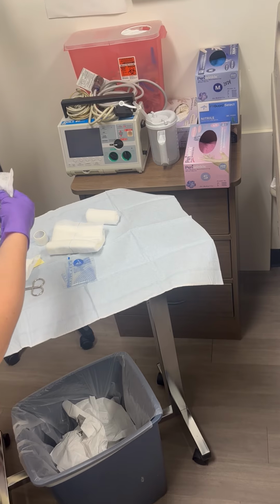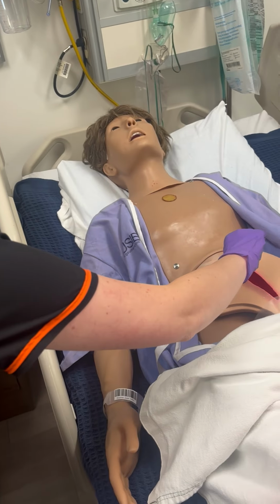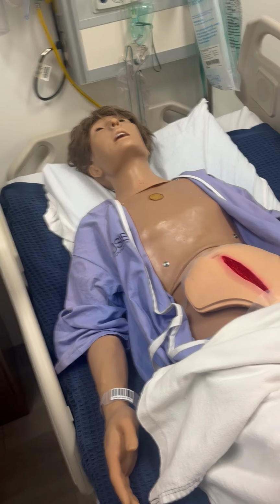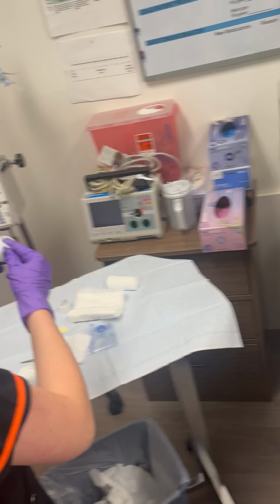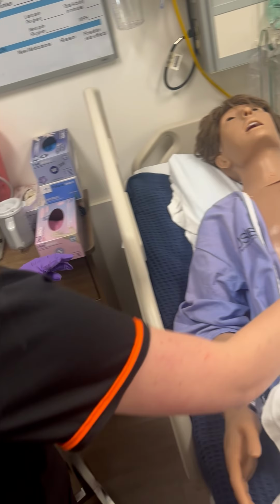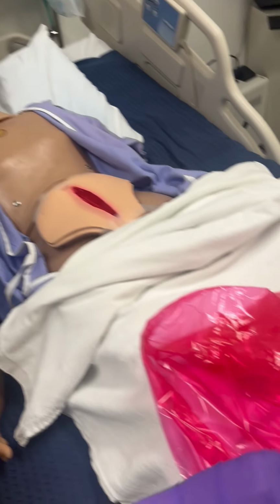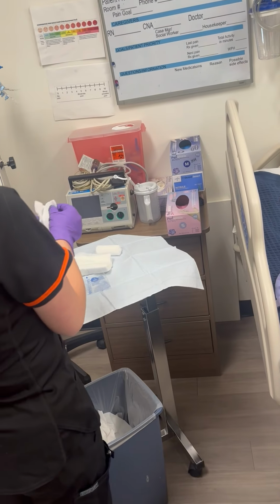All right, let's dry my patient off. So we'll get another sterile gauze, and we're gonna dry down the patient, just dabbing so that we don't cause any friction or shearing. Okay, one more. And just making sure I don't touch it, just dabbing down that patient. Perfect.